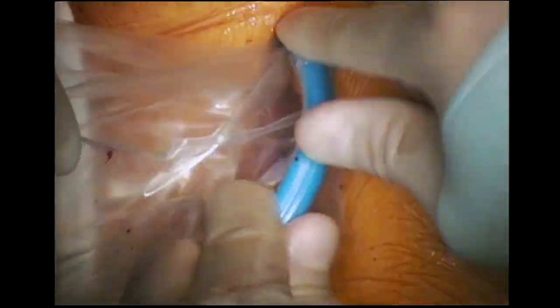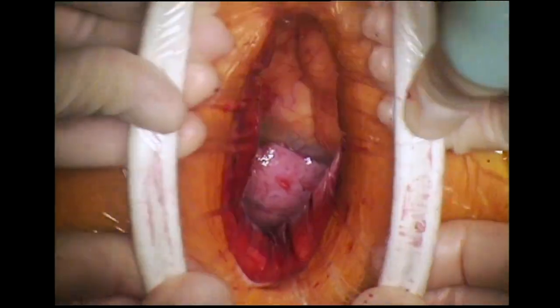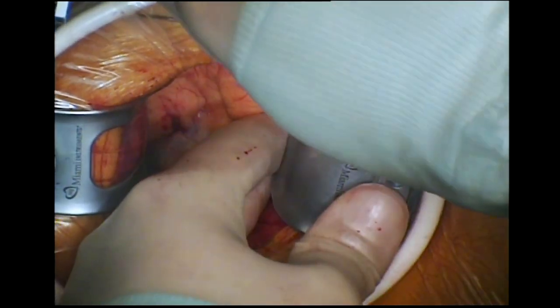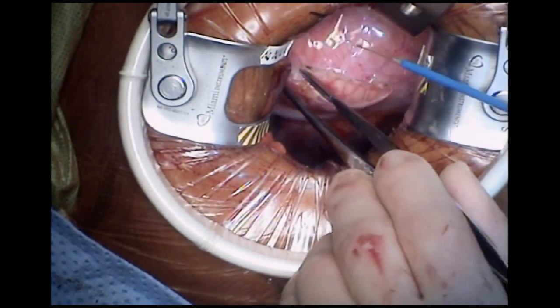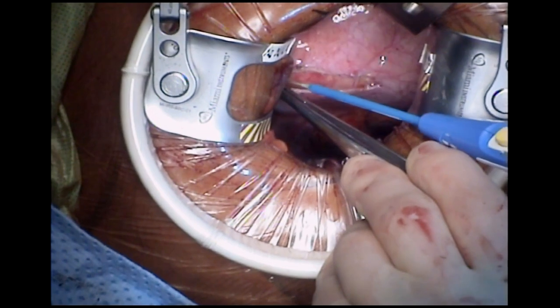A CO2 line is put in place followed by an Alexis Surgical Soft Tissue Retractor. A low profile retractor is now inserted to improve exposure, and if the patient has a fatty thymus, a portion of this may be removed to gain good access to the pericardium, which is now opened. Care is taken to identify the phrenic nerve to avoid injury to it.